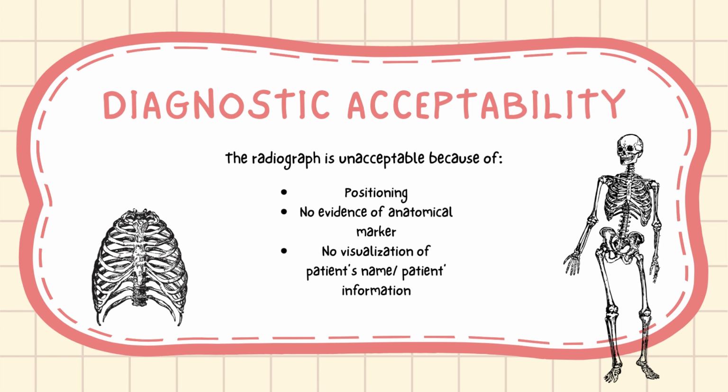To conclude, the radiograph is unacceptable because of the positioning, because there is no evidence of an anatomical marker, and also because there is no visualization of the patient's name or identification or patient information.